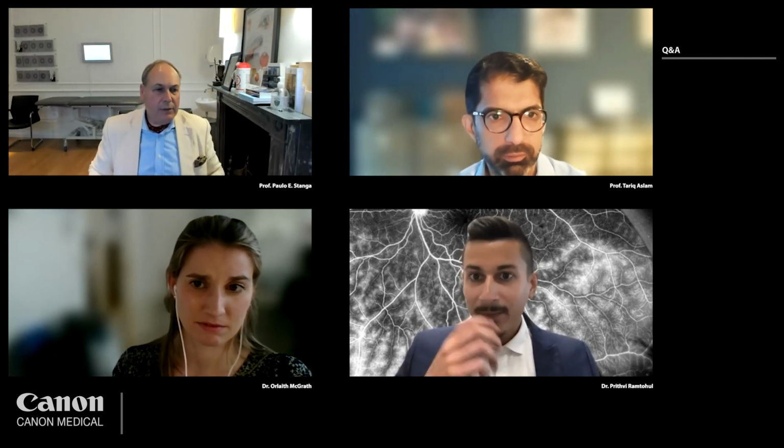No, that's okay. Prithvi, talking about CSR, do you diagnose CSR based on ICG, OCT, or both? I would say both, and also on fundus photography features. So yeah, we use ICG angiography in all our CSC patients, especially if we want to do PDT treatment. So we do ICG angiography for treatment. And now we're also investigating wide field OCT imaging on these patients. So we also do this imaging on these patients, yeah.